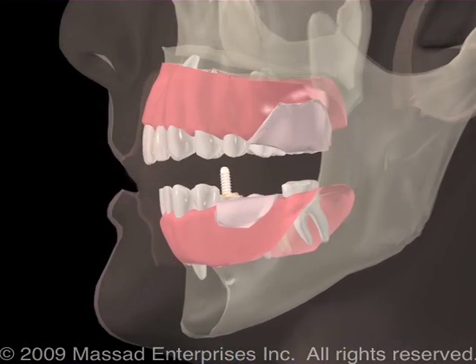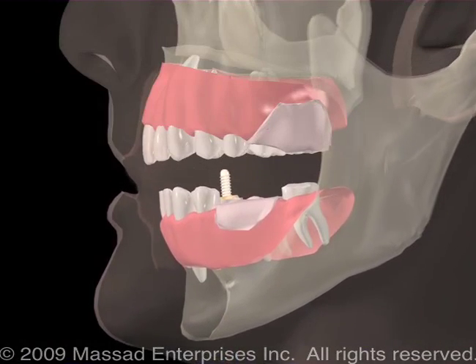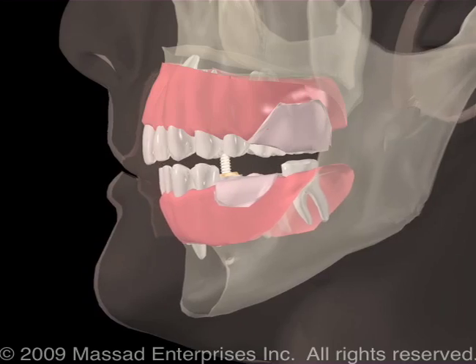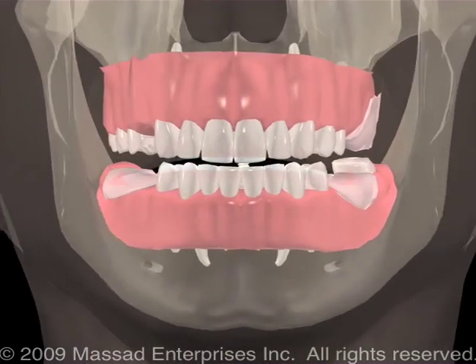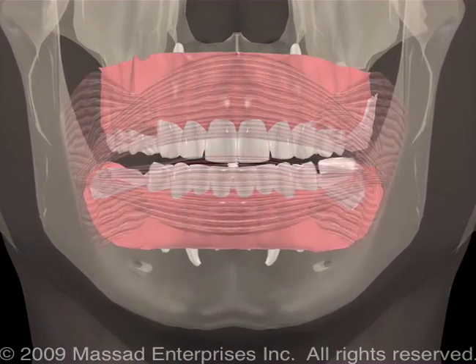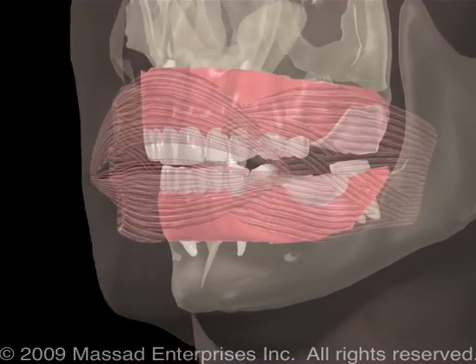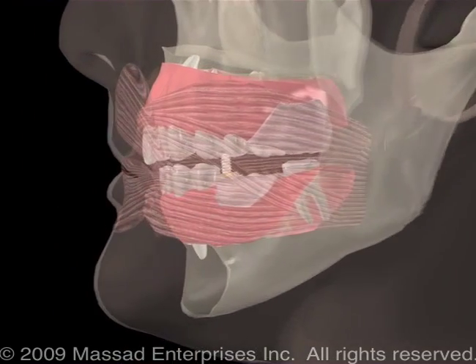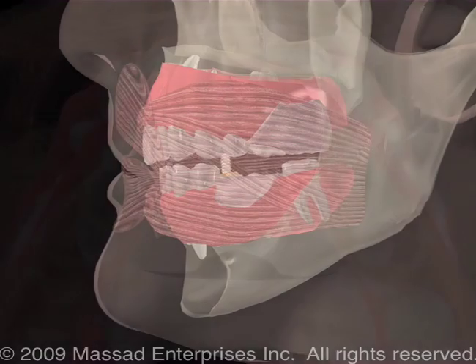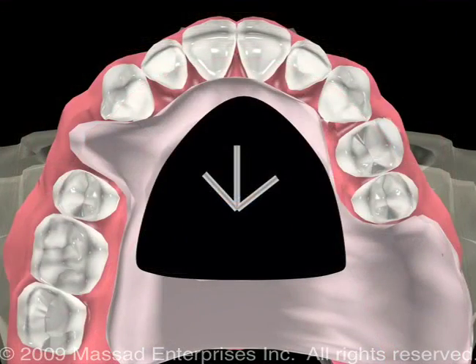Once again, the patient will tap in order to assure that the bases are not rocking and then slide their jaws in a forward and back position and then side to side position. Once again, this is repeated until the practitioner is assured that the patient is sliding smoothly without inhibition. Again, when this process is completed, the practitioner must then analyze the tracing to be assured that the patient has produced a centric relation arrow.